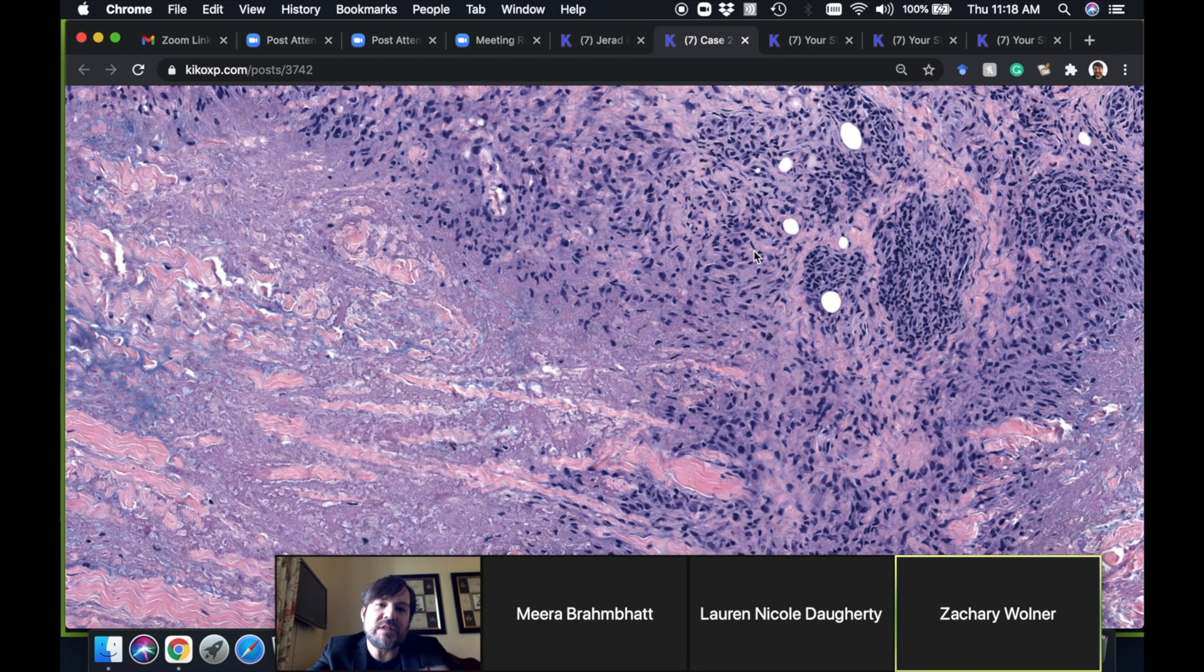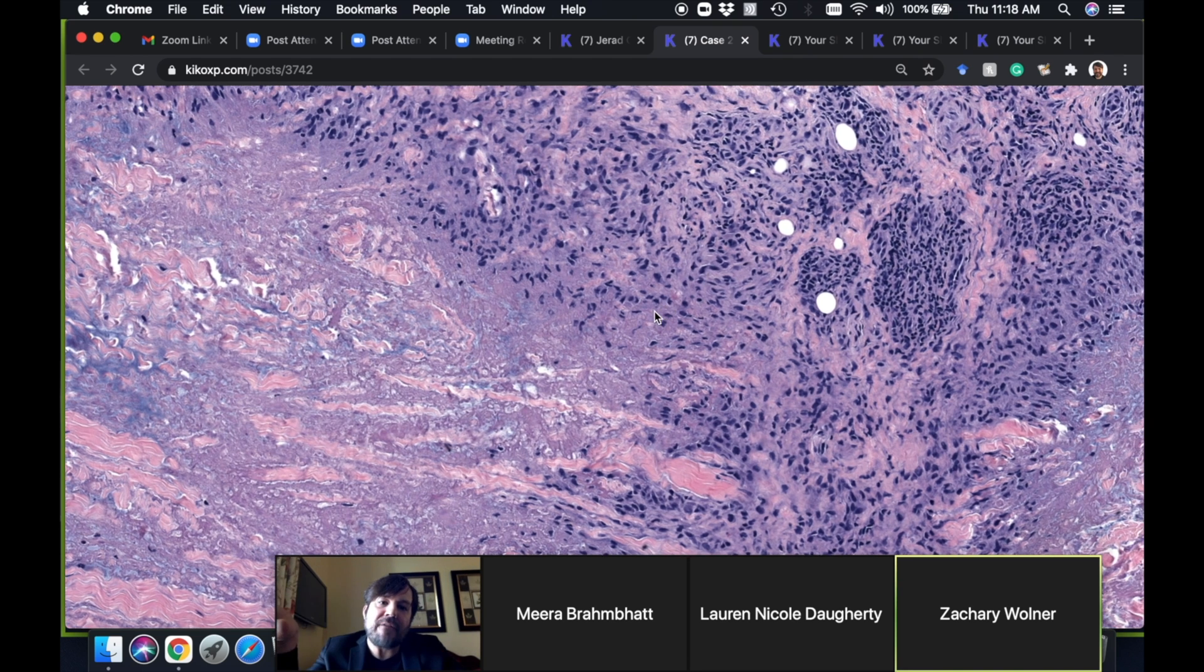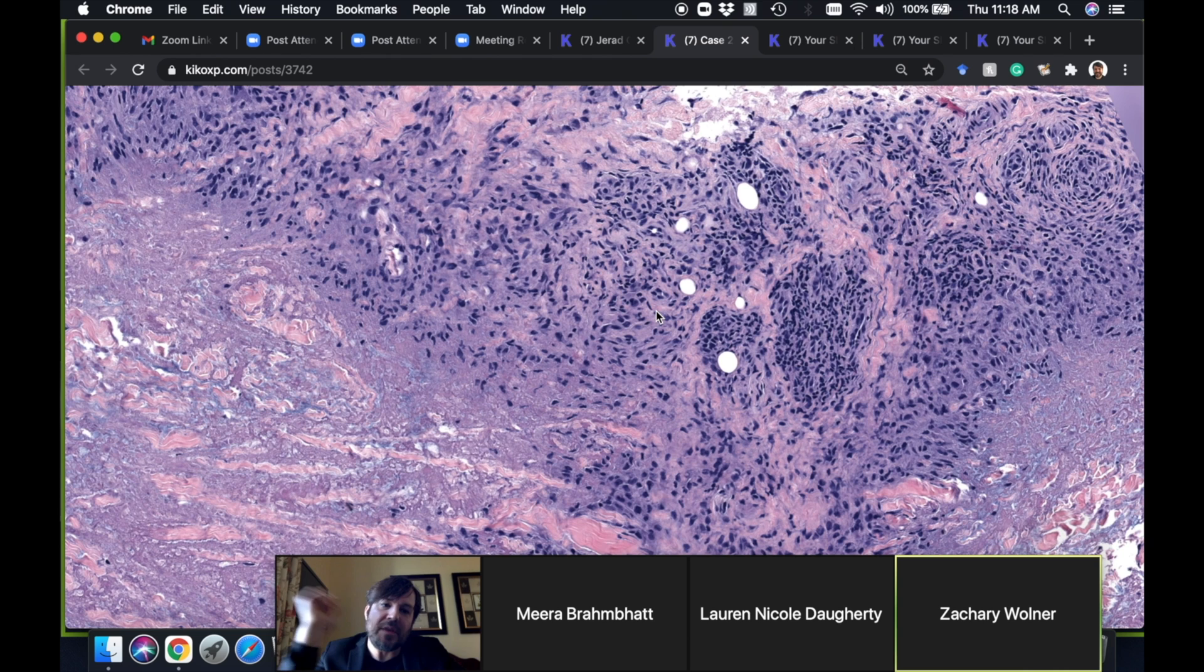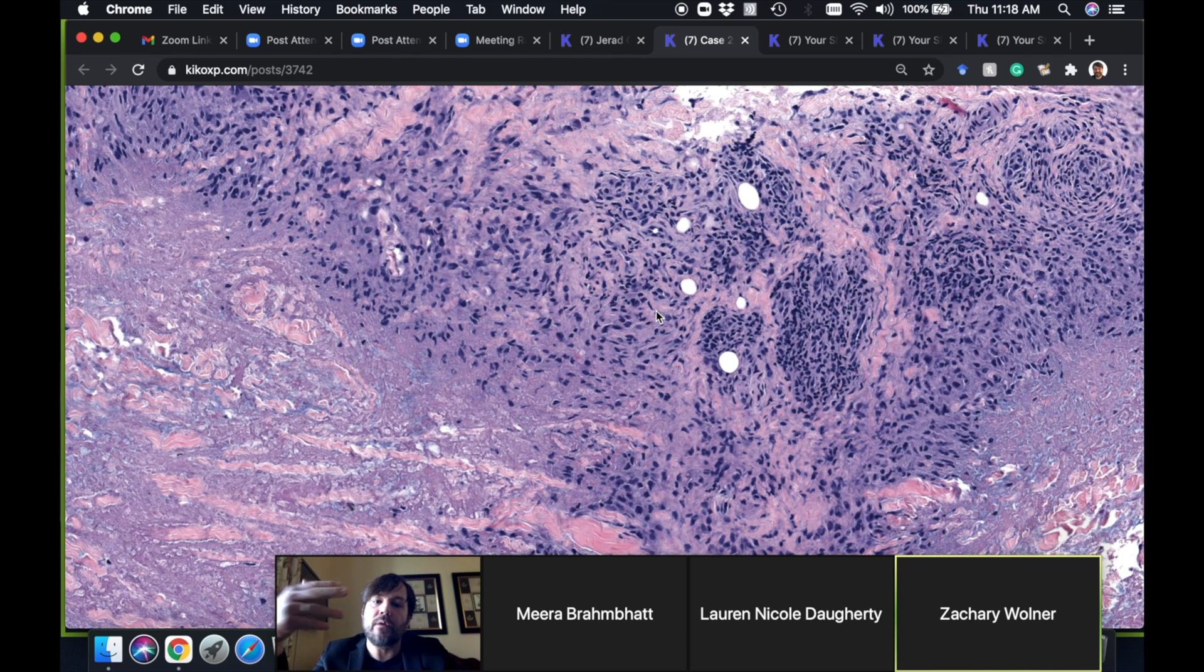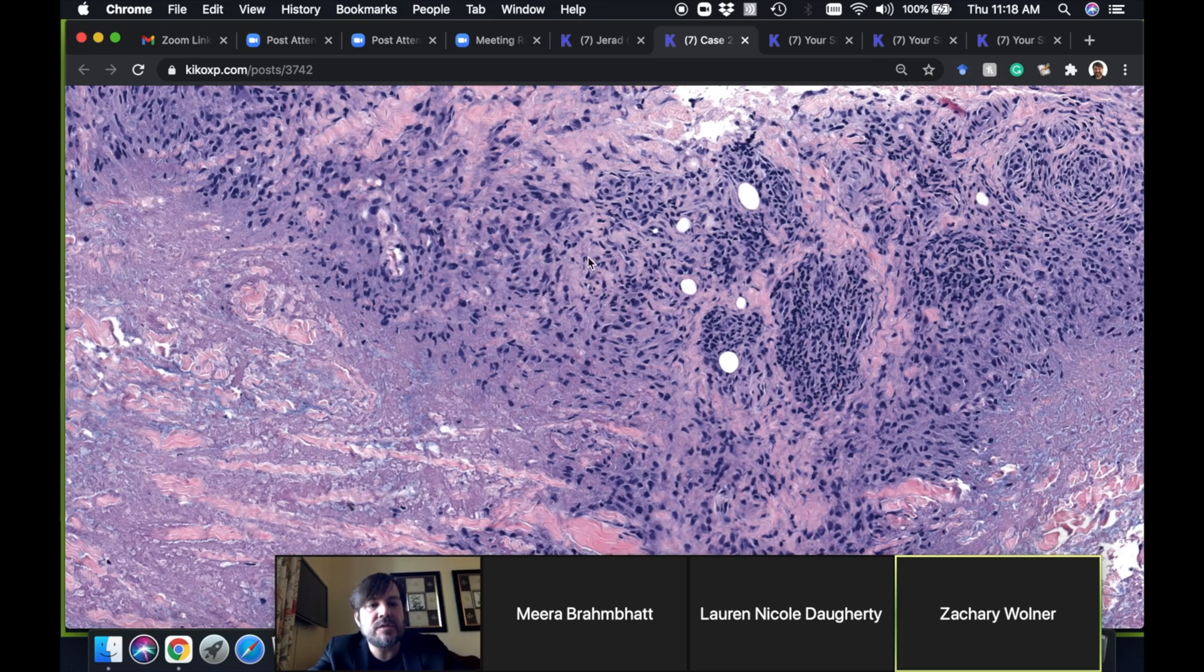You don't usually see tight sarcoidosis-type granulomas. If I see that, that usually steers me away from GA and makes me think of other types of granulomatous disease like sarcoid or infection. Any questions?